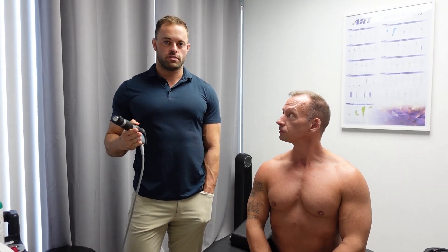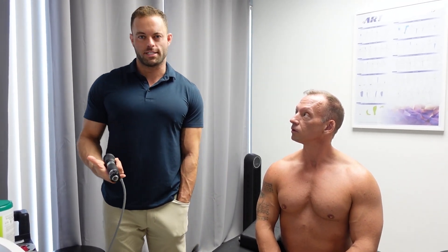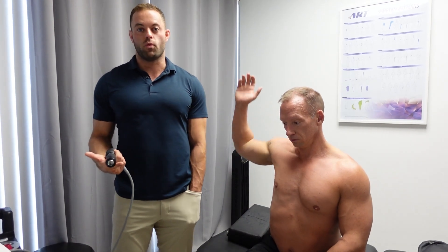One of the things patients will experience is their pain will actually improve throughout the session. They'll notice that by the end of the treatment they have less pain in the areas that were painful before — that means the Shockwave is already starting to take effect. Some patients will walk out of here with 25-30% relief by the time they walk out the door, which is pretty incredible because usually stuff like that takes weeks.